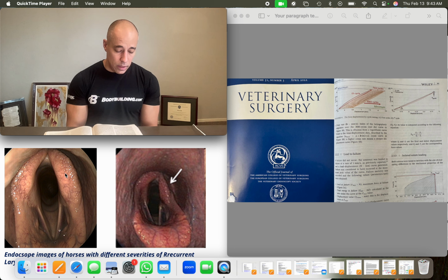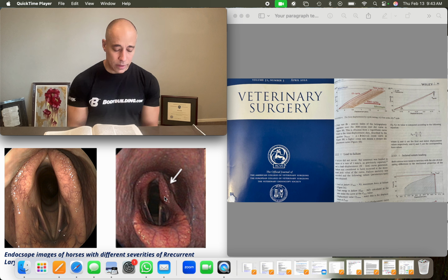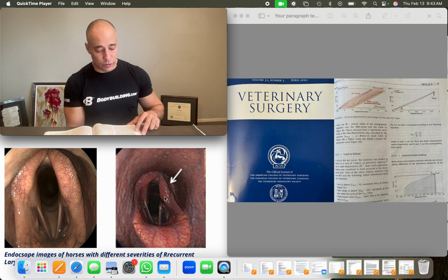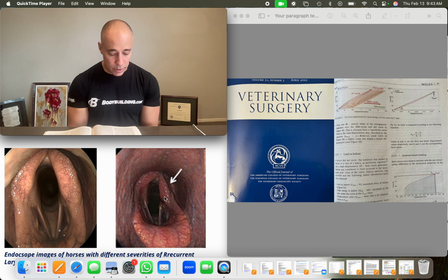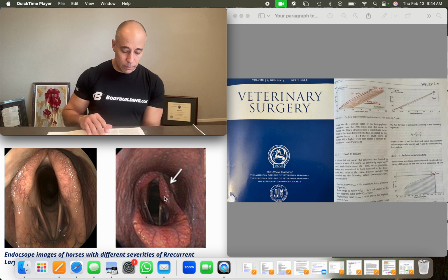So, introduction. The reported success rate of prosthetic laryngoplasty in racing horses ranges from 38% to 70%. Loss of arytenoid abduction, which is what this is here, after surgery is the most common complication following laryngoplasty, usually in the first week postoperatively. Multiple factors seem to be involved with this loss of abduction, including suture slippage or cut through cartilages. The polyester sutures, so the Ethibond, in human surgery, their use has been supplanted by polyblend sutures, which have higher tensile strength. A novel polyblend tape suture designed for human rotator cuff repair, called the Tiger tape, has demonstrated increased resistance to tissue cut through during mechanical testing.